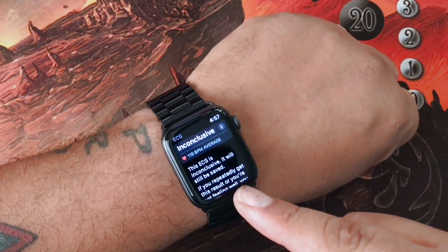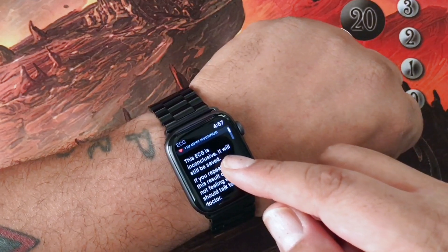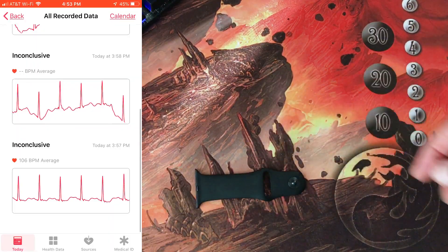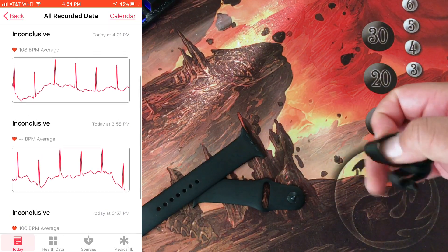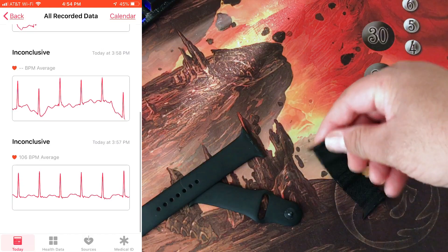And you get inconclusive. That's all I've been getting — inconclusive — every test so far. Why? I tried different bands: the rubber band, the Milanese loop, this magnetic one. Does it work? I'm not sure.